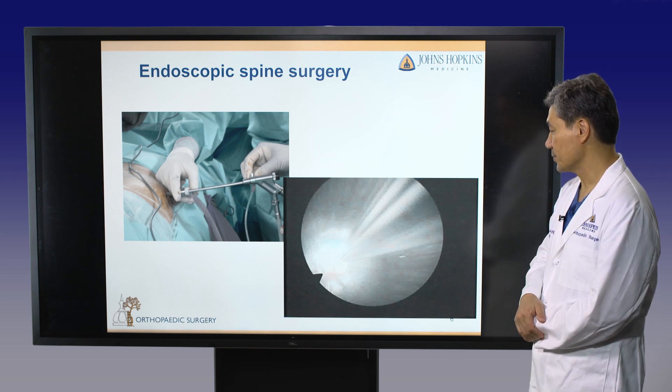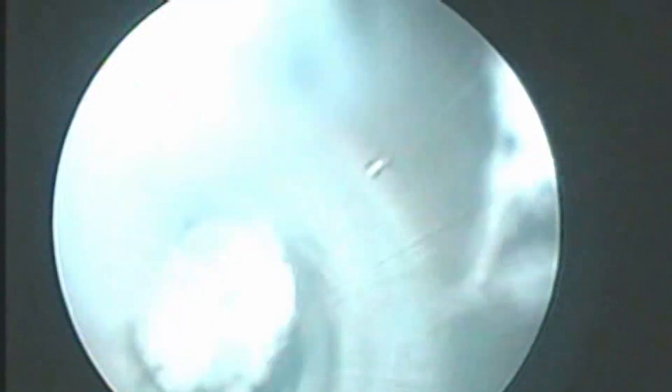This is a video clip showing the procedure of disc removal using spinal endoscopy. After disc removal, you can see the epidural space and the freed nerve root.